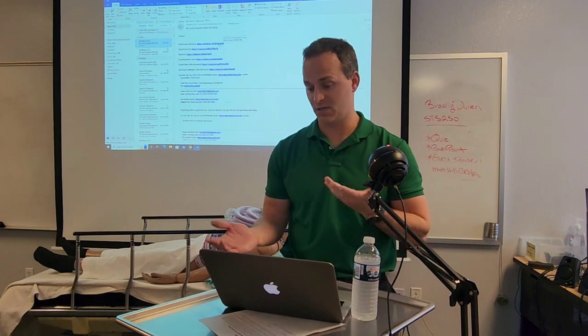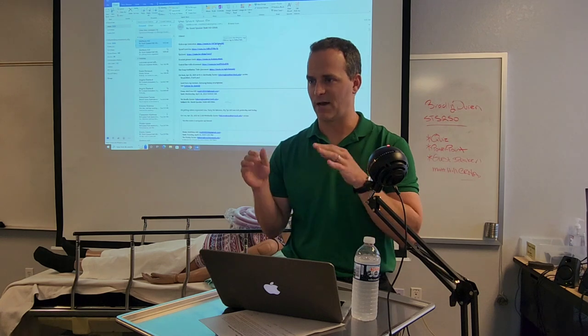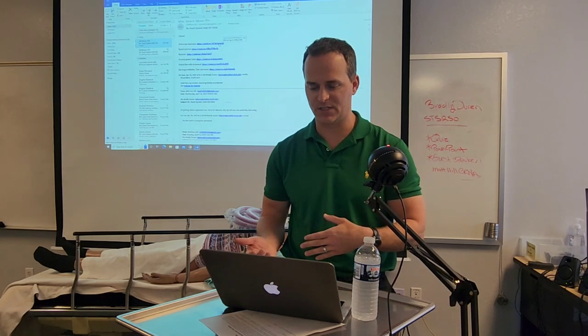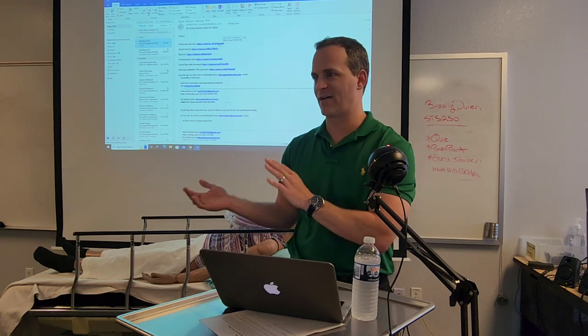So how do you know a patient is asleep? I mean, if you're just looking at them and you see the monitor, we know based on their vital signs, so their blood pressure, heart rate, breathing rate might lower. The volume of breath they're breathing might lower. We also know based on statistics, so we worked out the math to accurately state the patient will most likely be awake at this gas concentration of sevo, which is a percent, or we know statistically speaking that this gas concentration of sevo will render like 95% of all patients asleep.